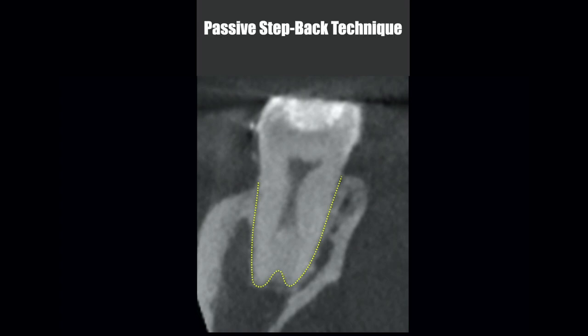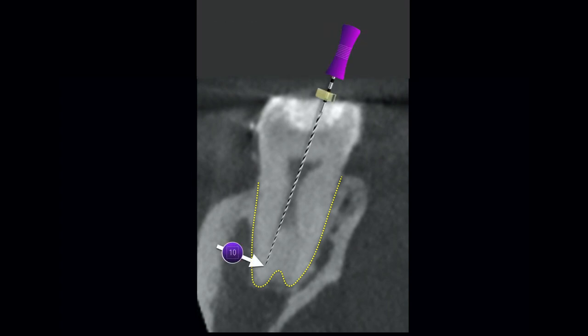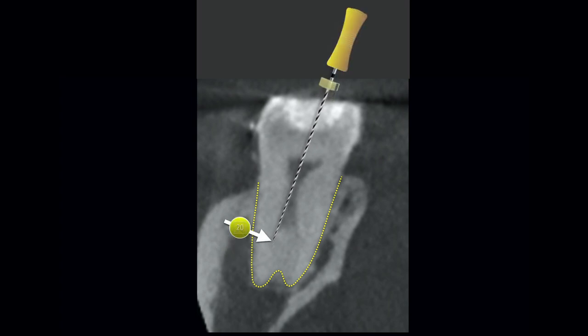I'll passively enlarge these canals by hand using the passive step back technique — a hand filing technique that removes mid-root interferences by using successively larger hand files in sequential order, each larger file advancing shorter than the last. We want to be passive with this technique and use it in the presence of a lot of irrigation solution that gets refreshed frequently. The more aggressive you are, the more at risk you are for creating a ledge. Once you can consistently enter both canals unobstructed, take your engine-driven instruments in and follow your normal shaping and irrigation protocols.